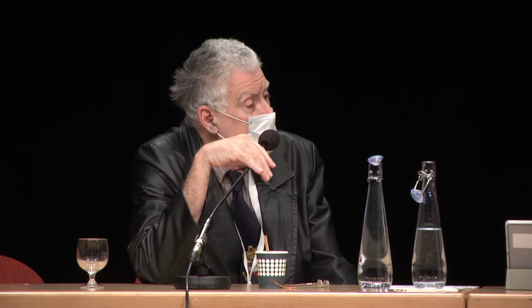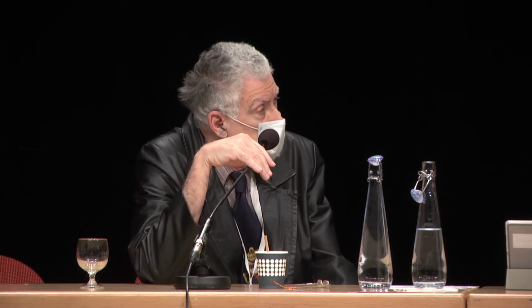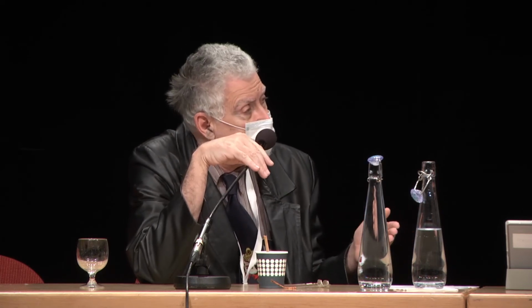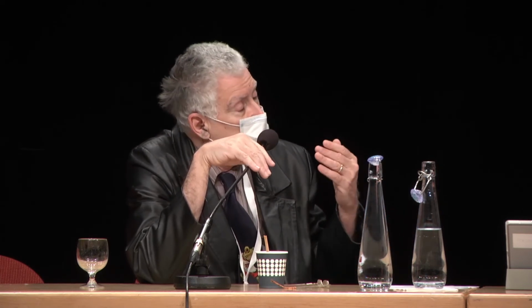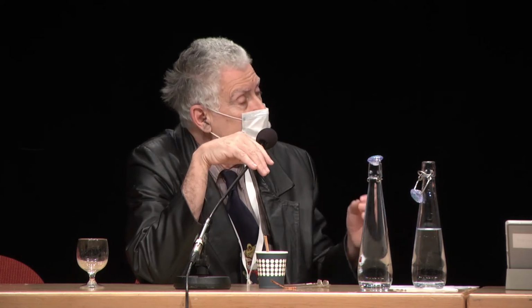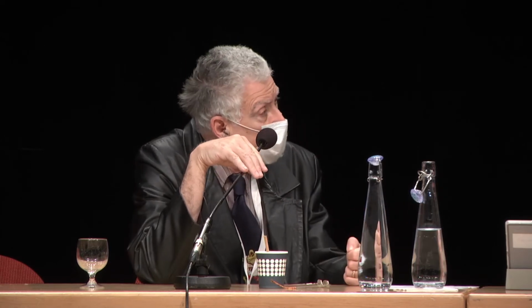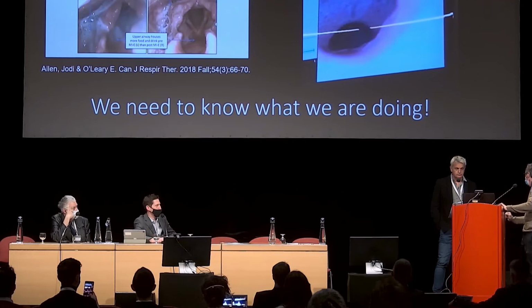Now, Tina, SMA1 is lower motor neuron disease, and we have lower expiratory flows on an exsufflator in children and babies, and that's why they get lots of pneumonias. But after they're 3 or 4 years old, that doesn't happen anymore, and maybe it's because they're able to cooperate with the machine. But certainly for the adult patient, it's a question of upper versus lower, and that can be upper spinal or higher.